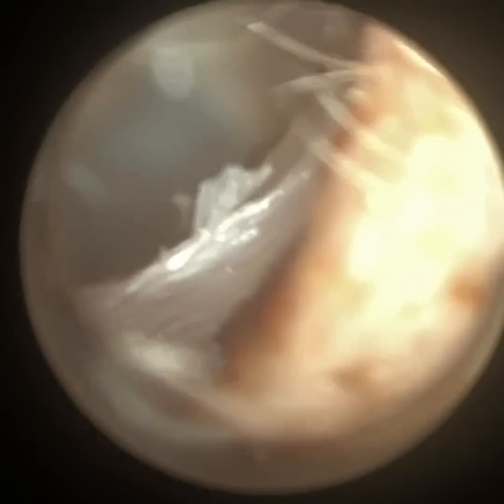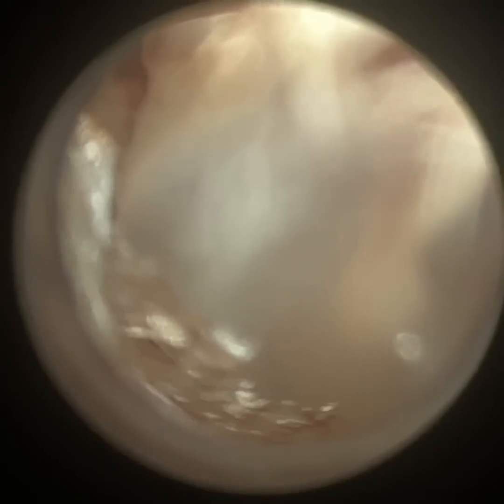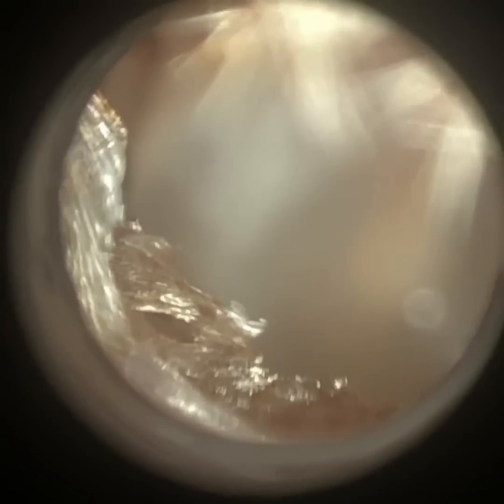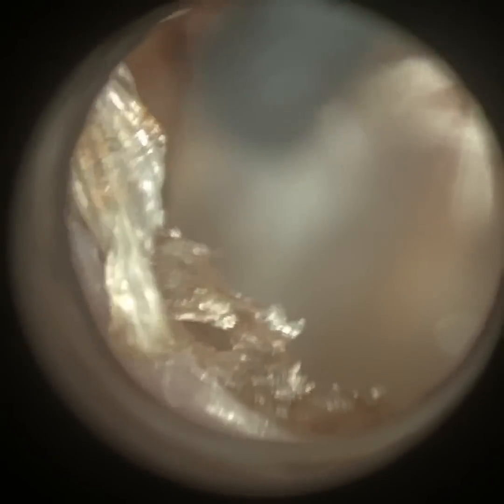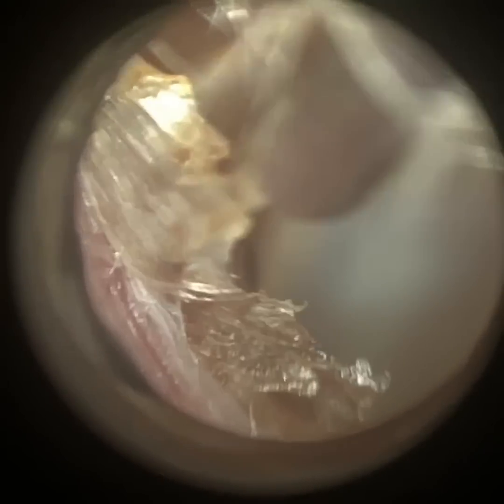Someone's got a really bendy and narrow ear canal, but if you manage to get that on the right hand side past the second bend and then straight in the ear canal, it just makes the speculum more stable in the ear, and it provides a better view because you can straighten and stretch the ear canal. You see, it's more comfortable for the patient. So now we're just working on the back posterior canal wall. Just some dead skin here.